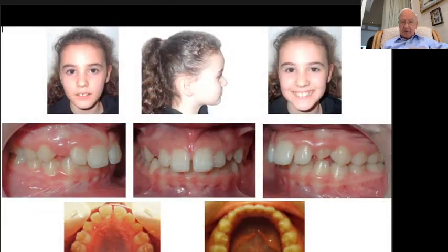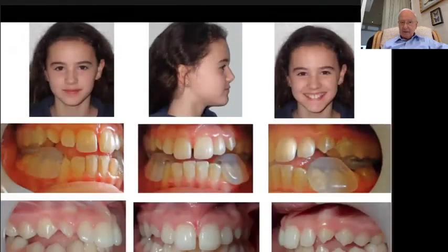This young patient is at an early stage in permanent dentition. The overbite is not deep in this case, and this is a mild Class 2 Division 1 malocclusion. This is the construction bite, the same as with the removable twin block, the conventional design. The construction bite is edge to edge with 2 millimeters interincisal space. The blocks are trimmed if necessary in the laboratory, and the profile improves when the mandible is advanced.